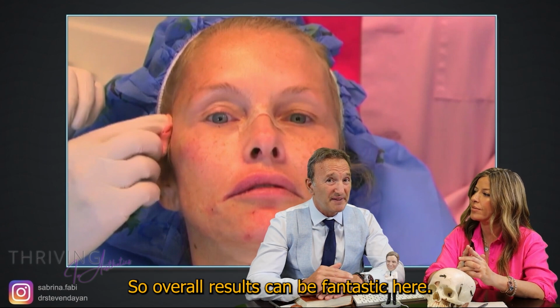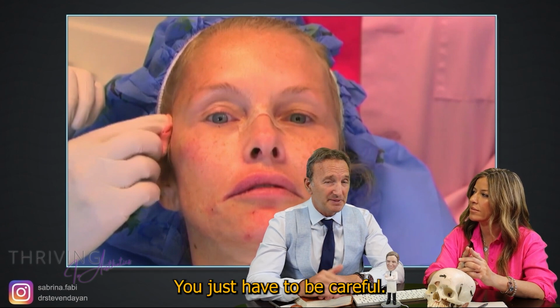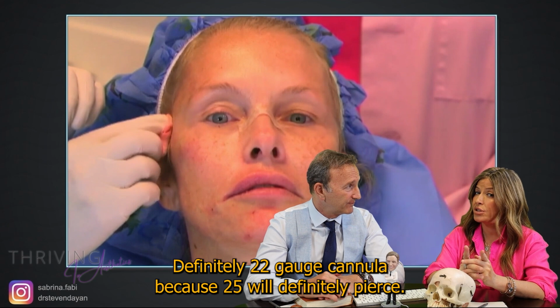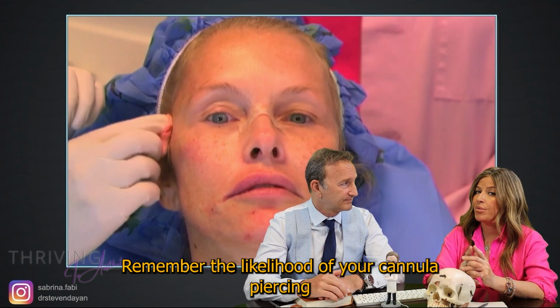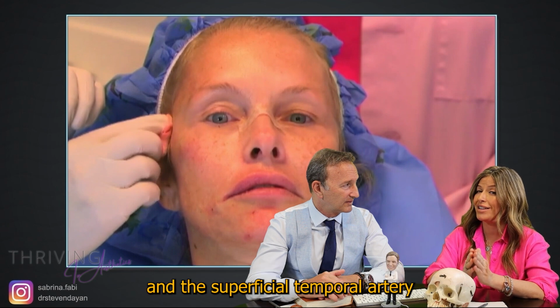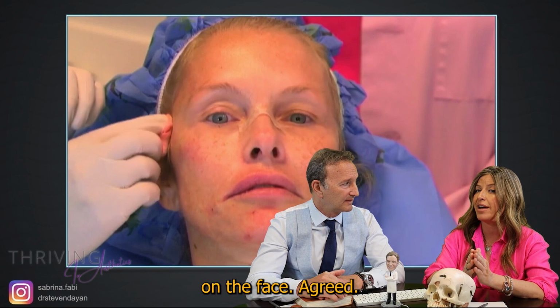So overall, results can be fantastic here. Cosmetically, really impressive results with this area, lifting the brows. You just have to be careful. I think technique is important here, and you need a little bit of experience. It's not a beginner's treatment. And definitely a 22 gauge cannula, because 25 will definitely pierce. Remember, the likelihood of your cannula piercing an artery is always dependent on the size of the artery, and the superficial temporal artery is one of the largest arteries that we're dancing with on the face.